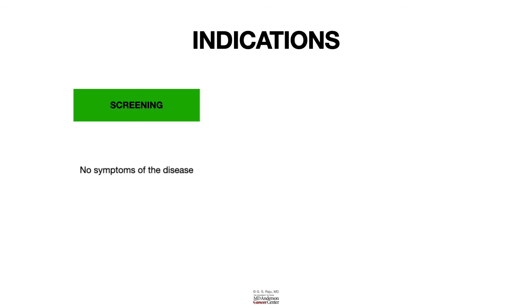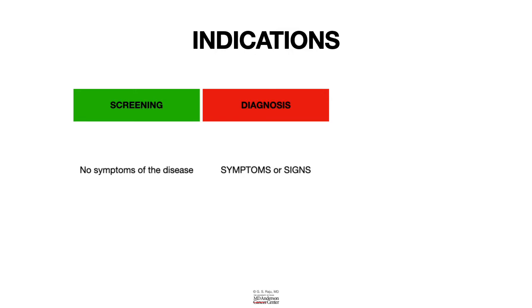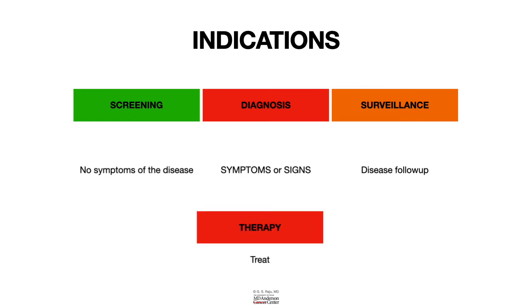It can also be used for diagnosis, especially if patients present with certain symptoms and signs of the upper GI tract. It could also be used for surveillance to follow up a particular disease. With advances in endoscopy, it can also be used for therapy, that is, to treat. So let us look at the screening indications for EGD.